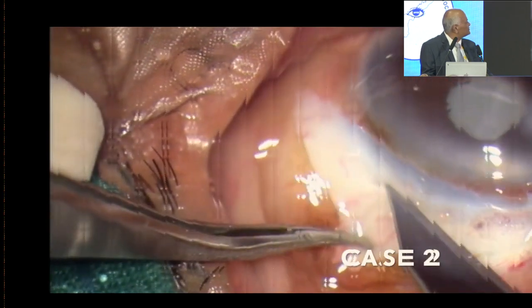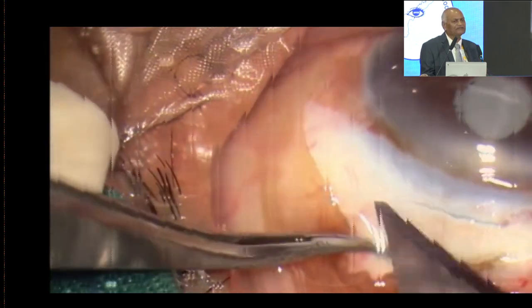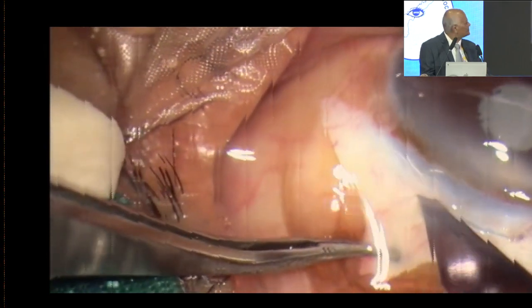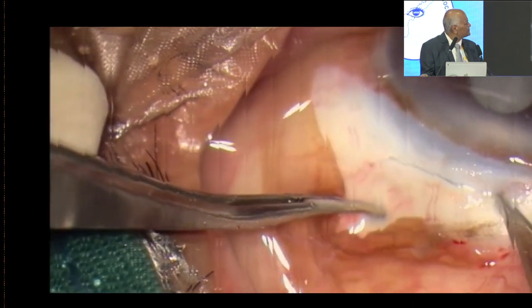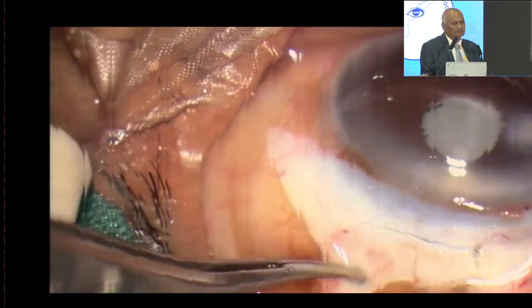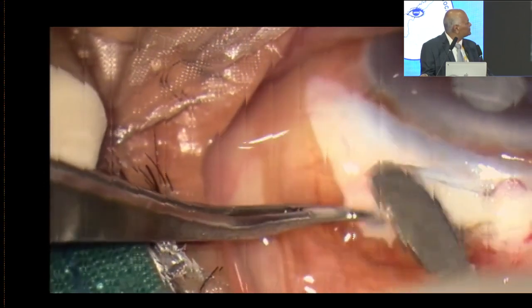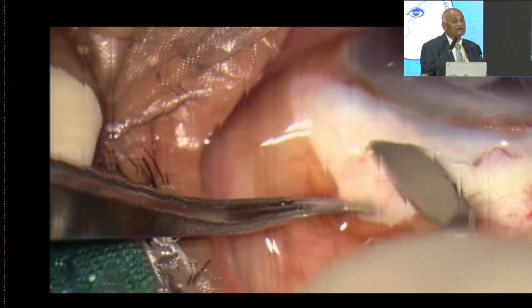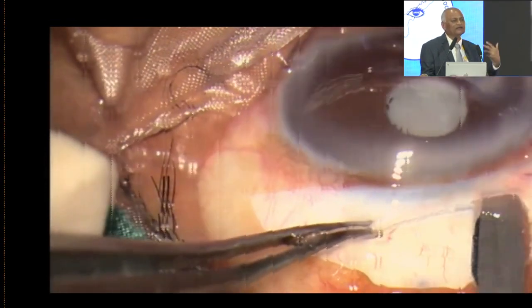Whenever the incision is taken, it should be slightly away from the blackish zone, that is the limbal portion, in the sclera. Again the extension on both sides, and once this is extended, you will again see the pockets. It should be in one plane. If there are ridges in between, the nucleus will not come out.